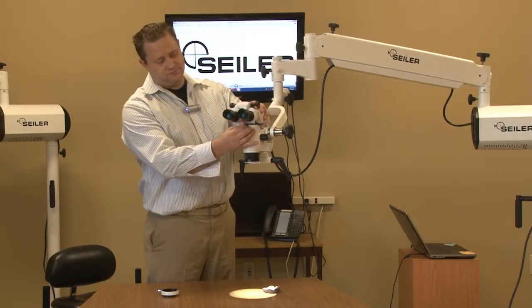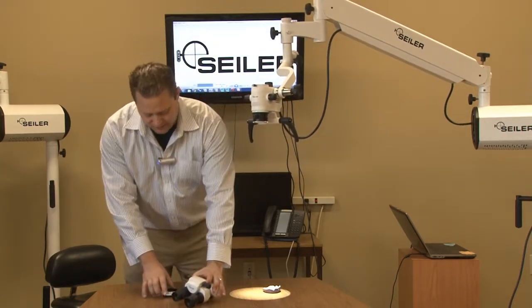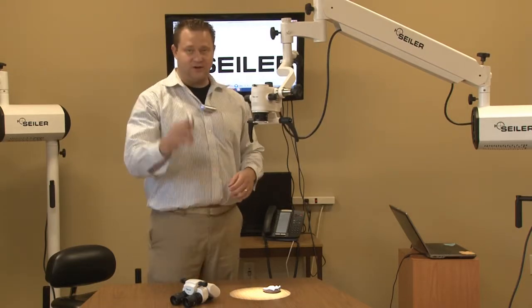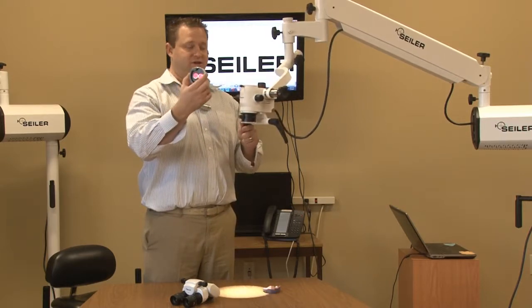What we do is remove the binocular head, and all the laser filter does is go in between the binocular head and the optical pod. This protects the end user from the lasers that they're using.